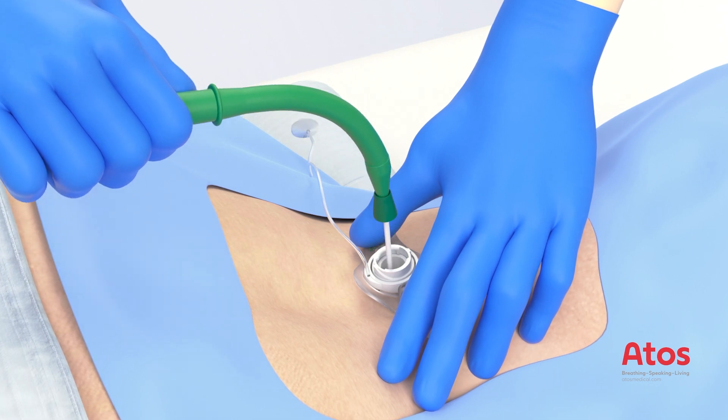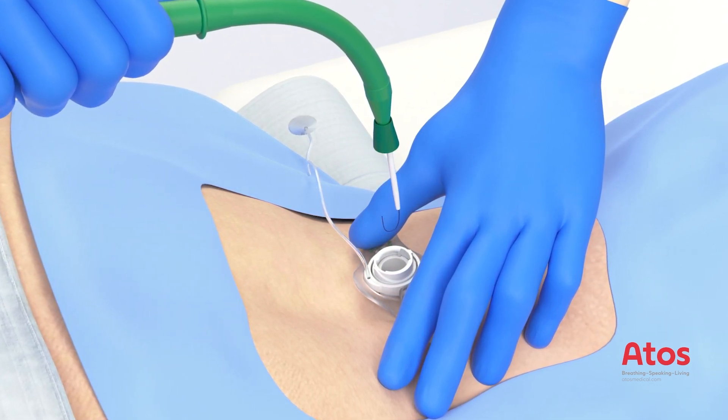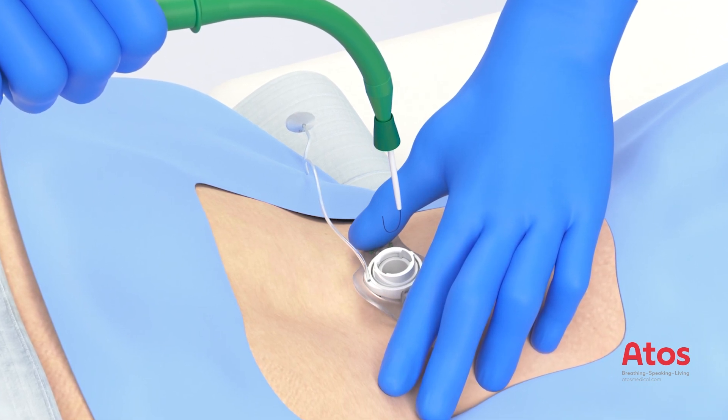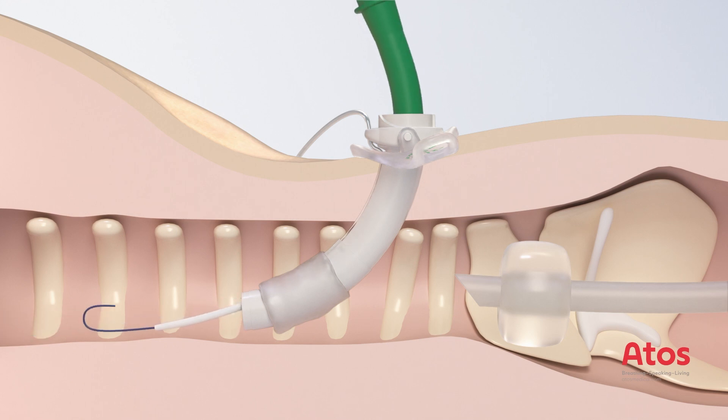Remove the guiding catheter and Seldinger guide wire. This can be done either in succession, starting with the inserter, or all together at the same time. While pulling the insertion system out, the silicone sleeve flips over automatically and can therefore be removed.